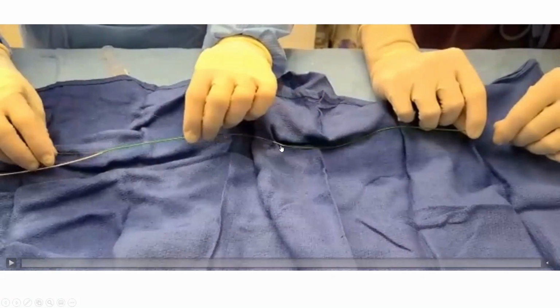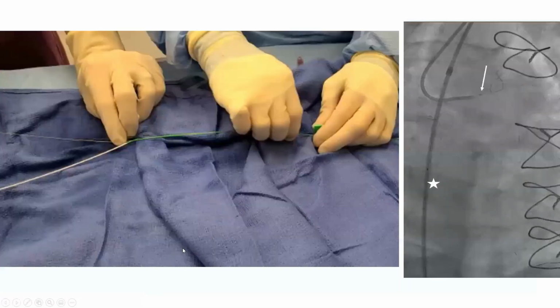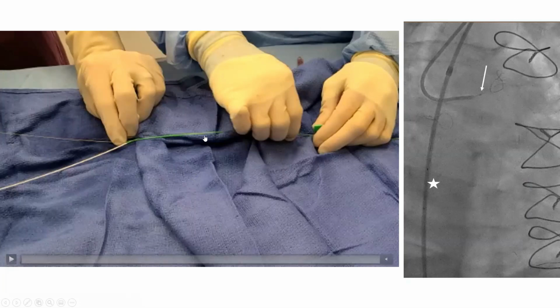Then you see here how the end is. You have the BMW wire, then you have the end of the green catheter, and you have the spider wire monorail portion. The spider basket is positioned here in the transparent portion, and it comes out at the back of the green portion. Again, this shows you the BMW monorail port, which comes out here, the collapsed spider basket, and the spider wire monorail portion coming out at the back of the green catheter. So there are two monorail areas, one for BMW and one for the spider wire, and the collapsed basket is in between.